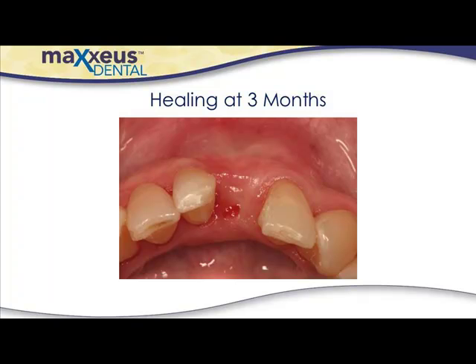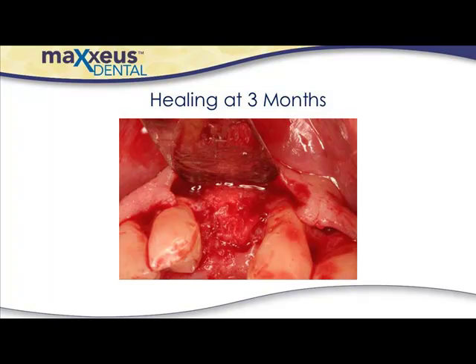Note the first appearance of a wide ridge for implant placement in this view of healing 3 months following removal of the temporary resin bonded bridge. Bony healing at 3 months shows excellent signs of vascularity and is remodeling nicely. At this stage, the bone is still remodeling and has a high percentage of osteoid tissue. These are excellent signs of new bone formation.